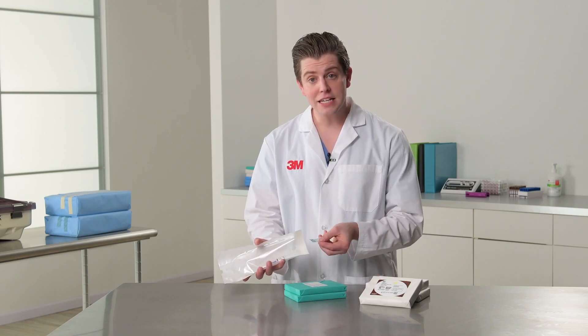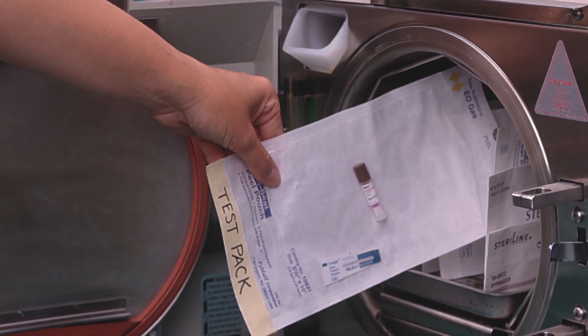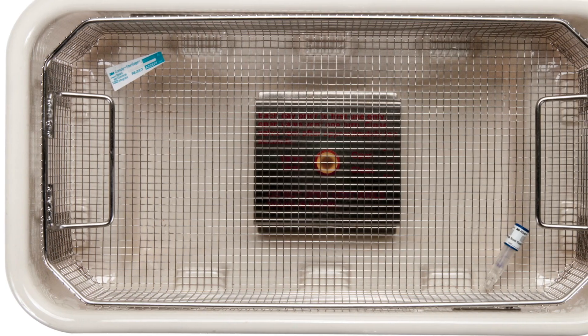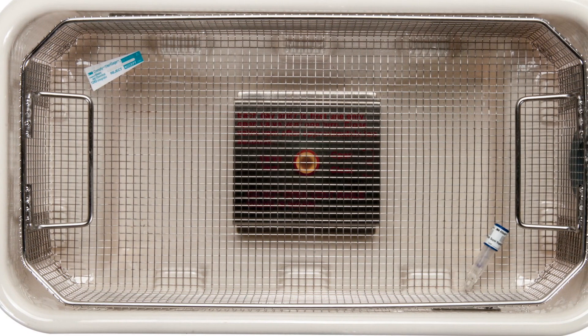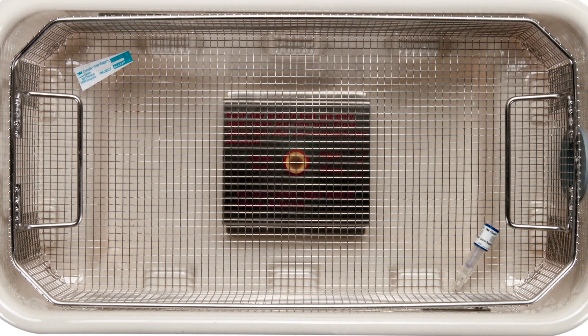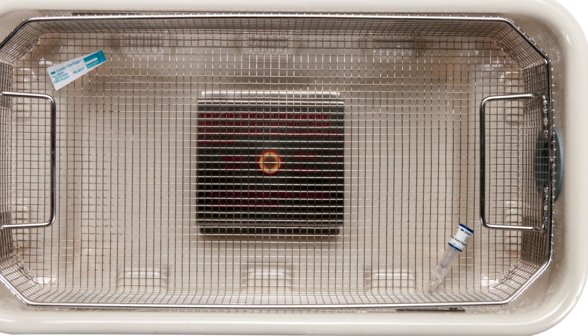For tabletop sterilizers you need to assemble a PCD that is representative of the contents of the load that is being sterilized. For example, if the tabletop sterilizer contains pouched instruments, place a BI and a CI inside of a peel pouch and run that in a full load. For gravity displacement cycles, assemble a BI PCD in the same type of tray that is being used to contain instruments in the load. If different types of tray configurations are used, each tray configuration should be tested.